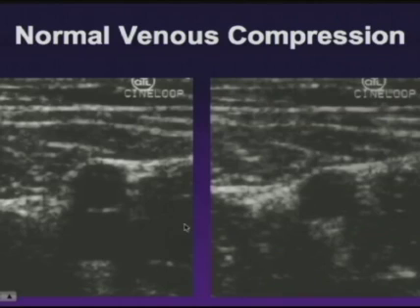Compression is quite simple. The artery and vein lie next to one another. When compression is placed, the vein disappears completely, and so here you see the artery and no vein. The vein compression usually is quite gentle and usually easy to accomplish. On some patients with venous hypertension, it may be difficult to completely compress easily, but if you see deviation of the artery, then the corresponding vein should be completely collapsed.